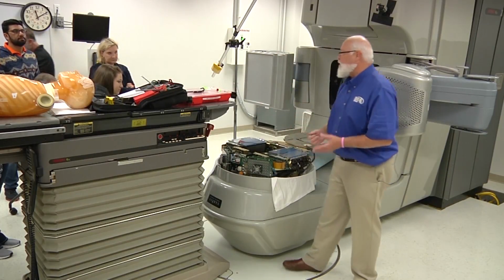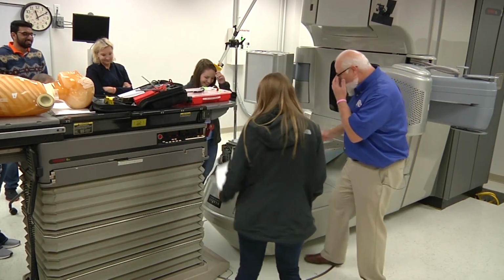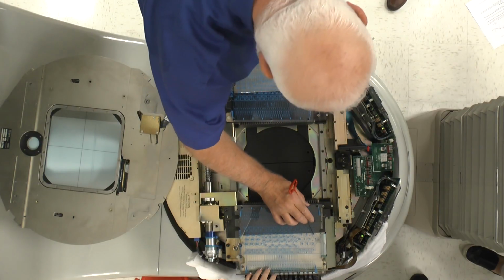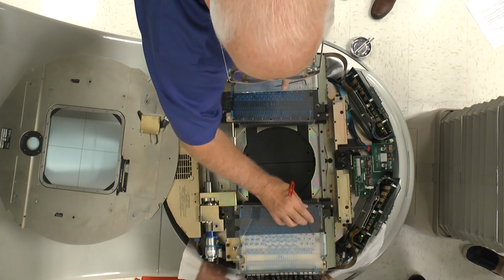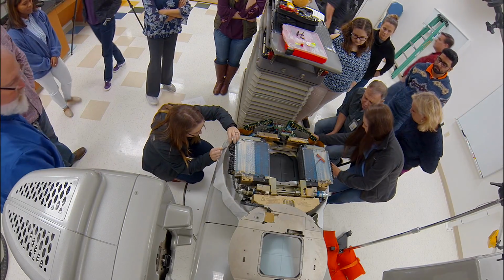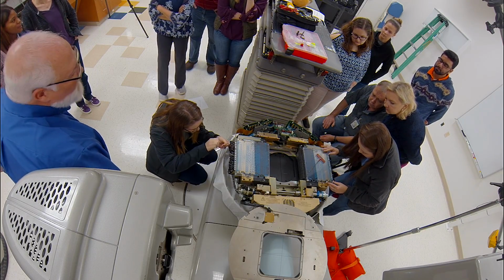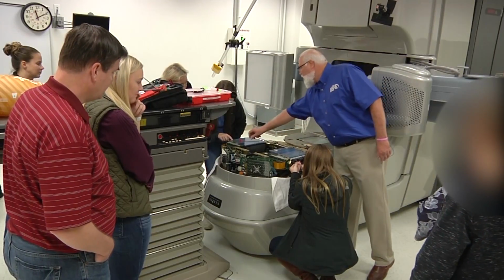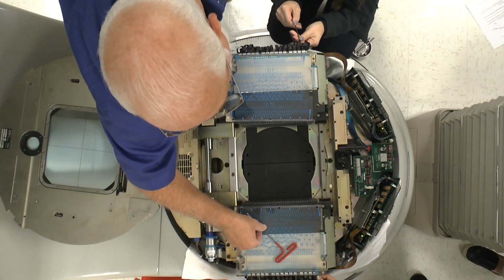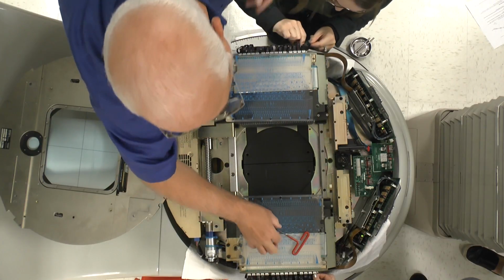Okay, 2 volunteers. Okay, so we'll just do the top one, and we'll do 3 on both sides. It doesn't have to be close. So how do you read this thing? So here's 3. So you come back here and it's going to be this top one right in the corner. And then the ribbon is going to be right up at the top. Yeah. We can just pull this so you get it.